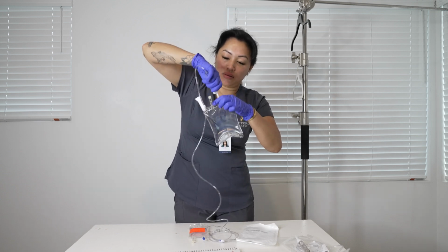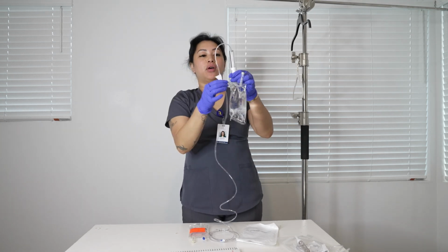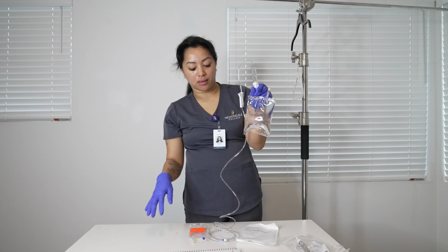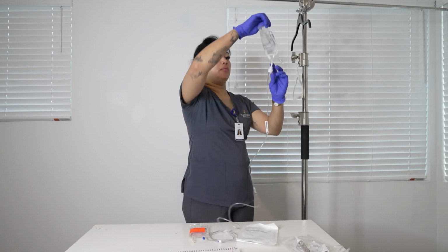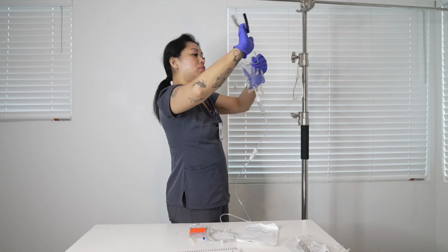It's a little hard. Okay. Now that I have inserted it, before I turn it over, I always have to make sure that the roller clamp is down to prevent any fluids from leaking all the way through. So now I am going to hang it up. I ensure that the roller clamp is down, so now I'm going to hang it up onto my IV pole.